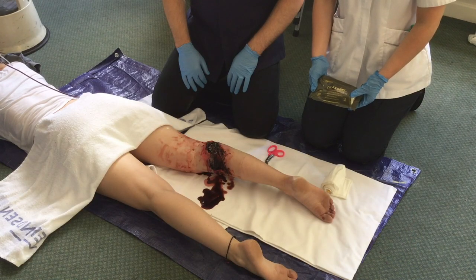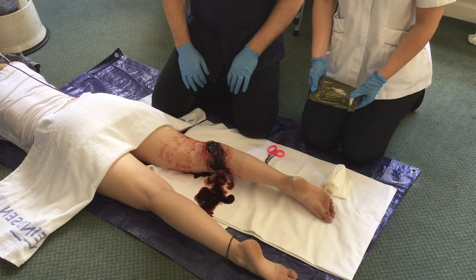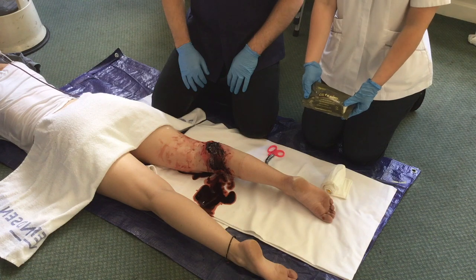Here we see an actively haemorrhaging lower limb soft tissue wound. A decision has been made to fill the wound with Seelox gauze in order to aid haemostasis.